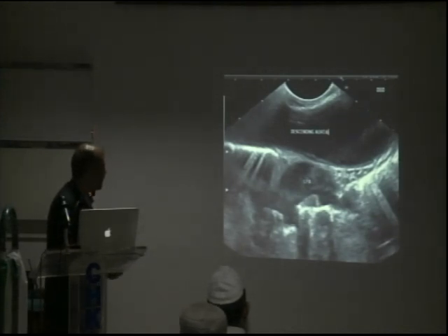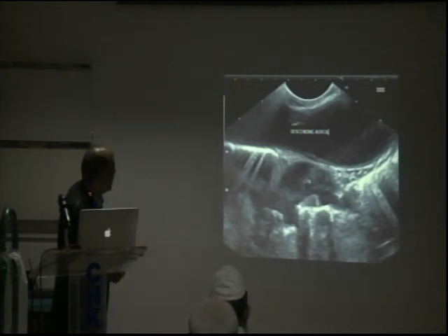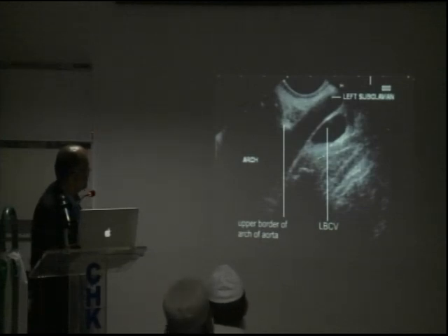This is the pleural surface here, which is reflecting. I think the basics Dr. Mustafa discussed. This is reflectivity once you have an interface, which is, all right, so this is one. Okay, this already we discussed that. I think I'll not go into that. Okay, this is in the neck. As I said, left brachiocephalic.